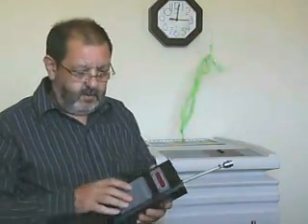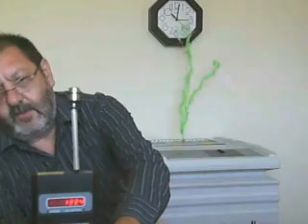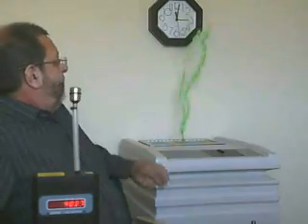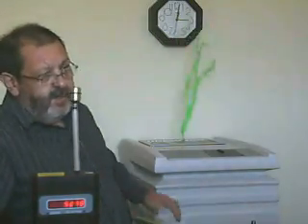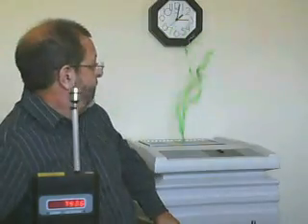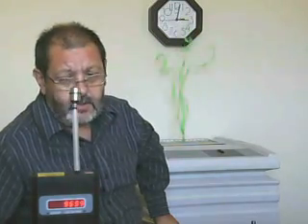Now, the particle counter that we use here is a MET1, and it measures all particles larger than 0.3 microns. Looks like we've had a couple of minutes there, so we'll do another particle count now and see how the particles are reducing. You can notice the airflow by the pretty streamers that we have. These are not supplied with the machine, so they would obviously have to be an optional extra if you require streamers.